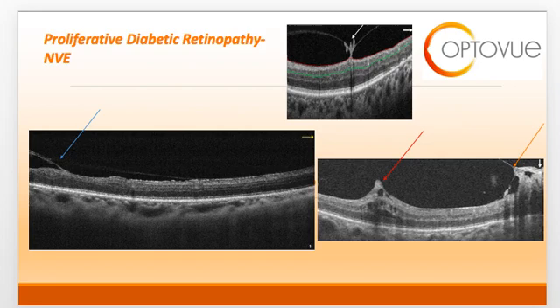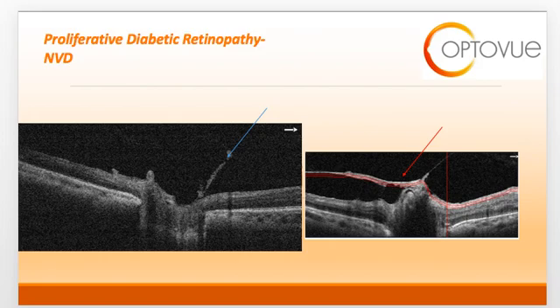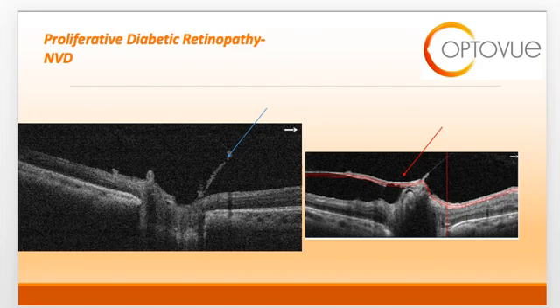Remember that there are more significant sequelae that can result from neovascularization, which we will discuss in a further slide. Here you can see neovascularization of the disc. Similarly to neovascularization elsewhere, NVD can emerge from the optic nerve and extend into the vitreous cavity. OCT is very helpful in differentiating neovascularization from IRMA, or intraretinal microvascular abnormalities, because IRMA are intraretinal and are not visible on regular spectral domain OCT. Neovascularization, on the contrary, is brilliantly illustrated on OCT as seen here.